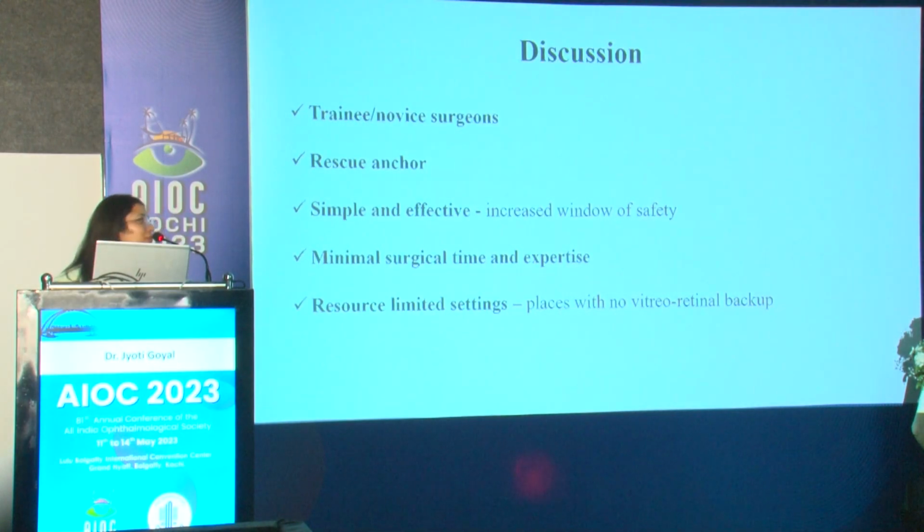Finally, I would like to conclude that this technique is very useful for trainee or novice surgeons, especially when they have many maneuvers to do, because there is a greater chance of haptic slippage in these novice surgeons. This sling acts as a rescue anchor, and it is a very simple and effective technique which increases the window of safety for all the novice surgeons.